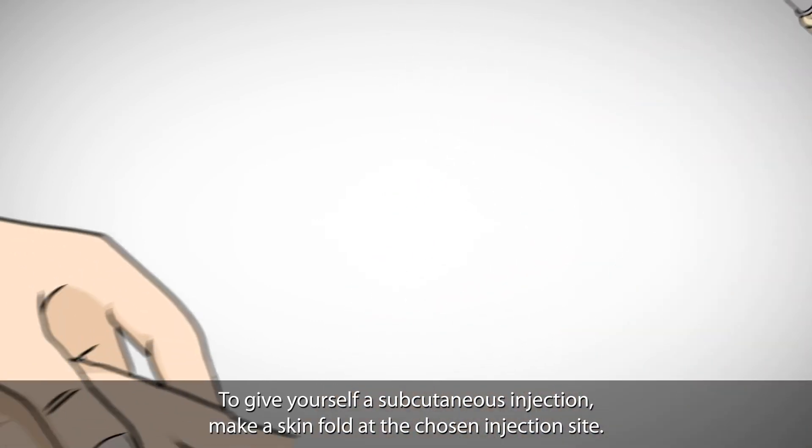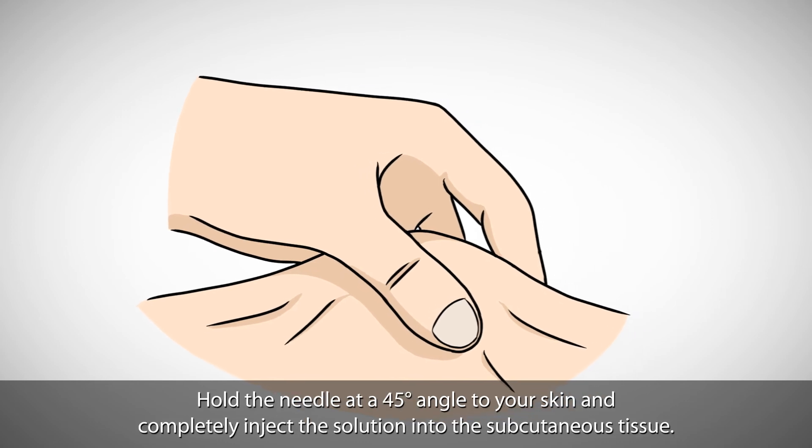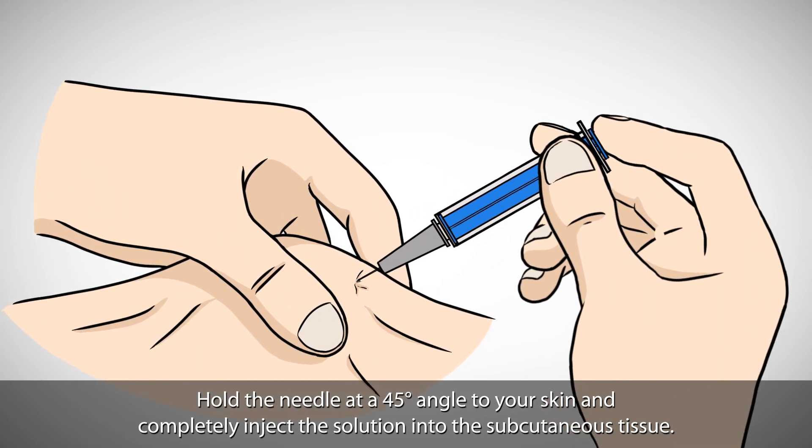To give yourself a subcutaneous injection, make a skin fold at the chosen injection site. Hold the needle at a 45 degree angle to your skin and completely inject the solution into the subcutaneous tissue.